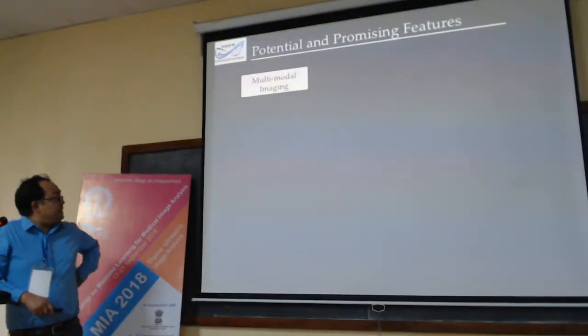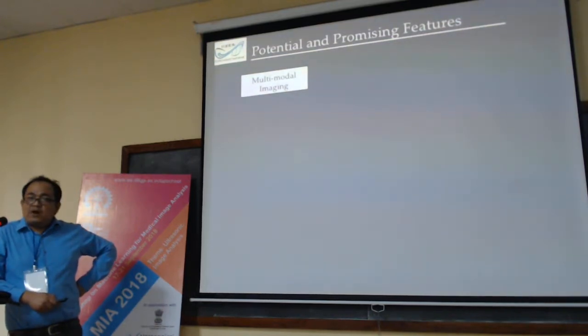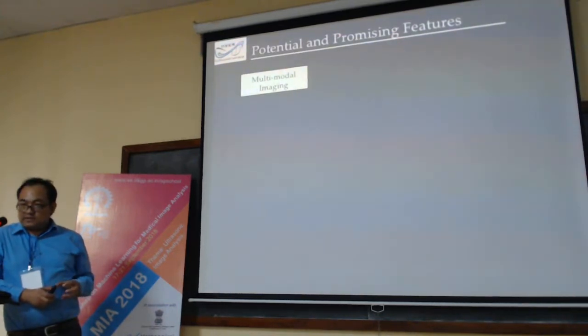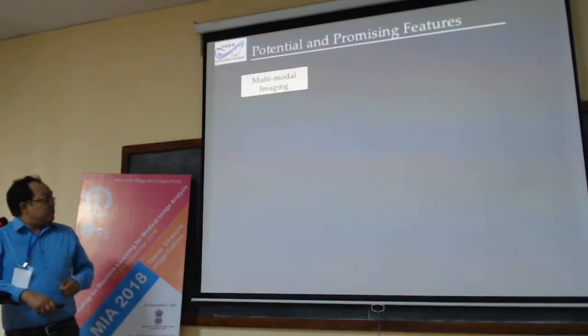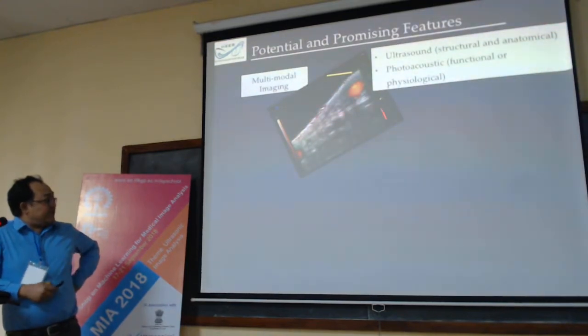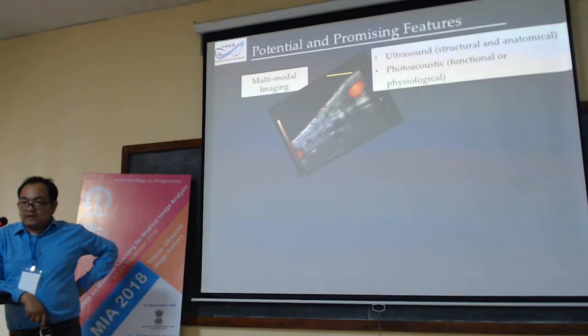Another aspect is the possibility of developing multi-imaging modality, combinations of two or more imaging modalities together, so that the kind of information that we can get from one imaging modality can be complemented with the others. It is very straightforward to get this from photoacoustic because it is a combination of optical and ultrasound.